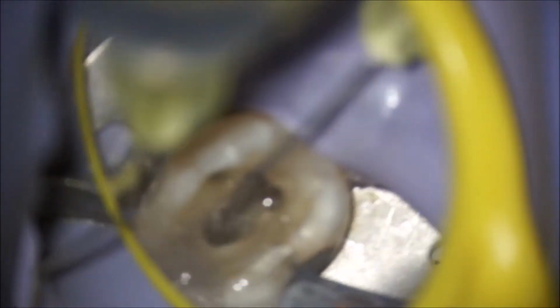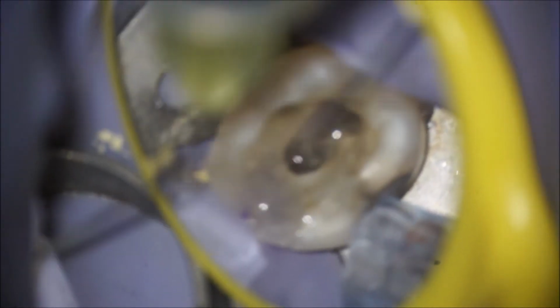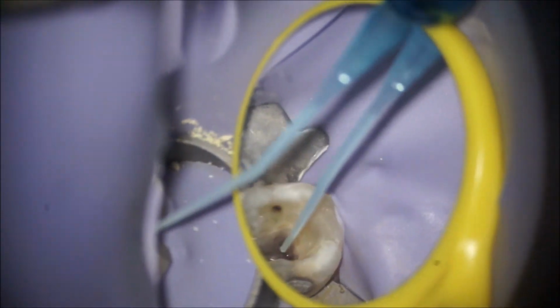Lots of irrigation while we did this so that you can keep all the debris in suspension as much as possible. One tip I can give you is to make absolutely sure that every little nook and cranny in there is clean. Those dentin flakes were hiding beneath all the little undercuts that were there.